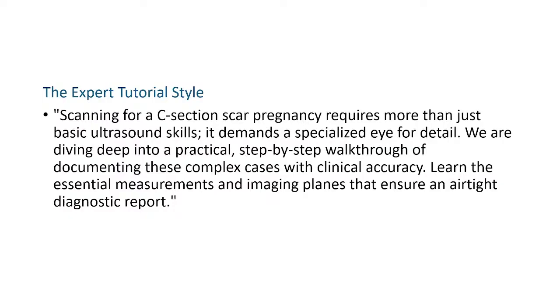We are diving into a practical step-by-step walkthrough of documenting these complex cases with clinical accuracy. Learn the essential measurements and imaging planes that ensure an airtight diagnostic report, a don't-miss situation where we have to make sure.